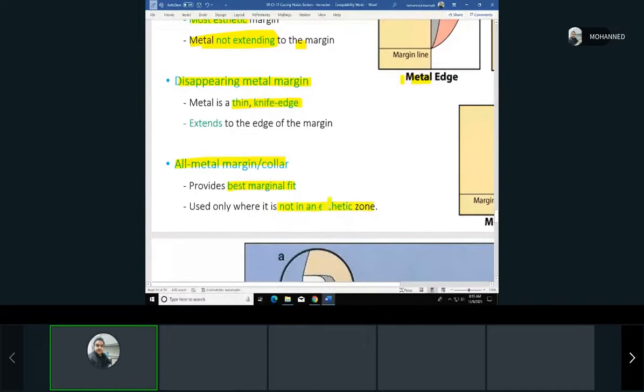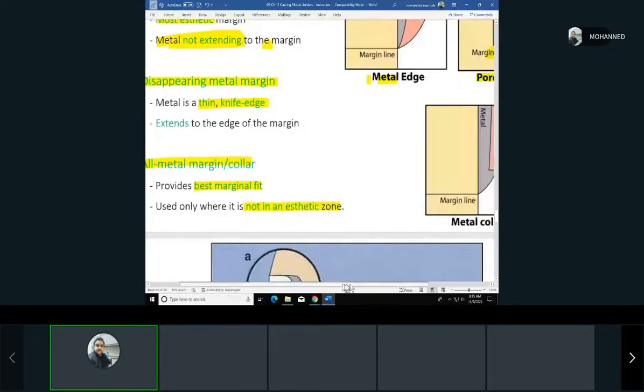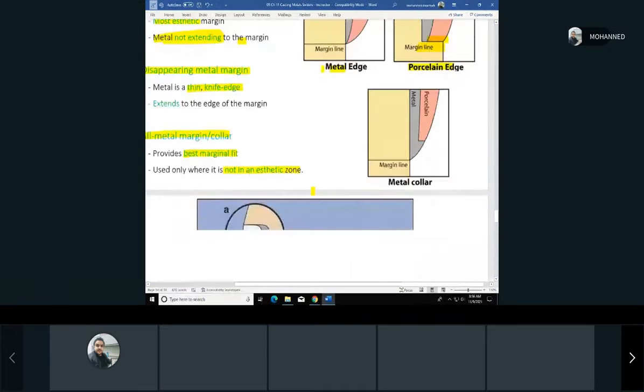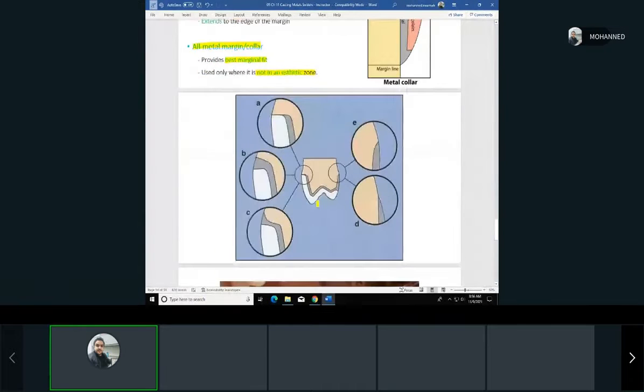So, again, because we don't want to see the metal appearing on the patient's tooth, this is the best way. If we have a posterior tooth that would not appear when you smile or open your mouth much, we can make the metal margin of it. Again, this is just to show you how it can be.